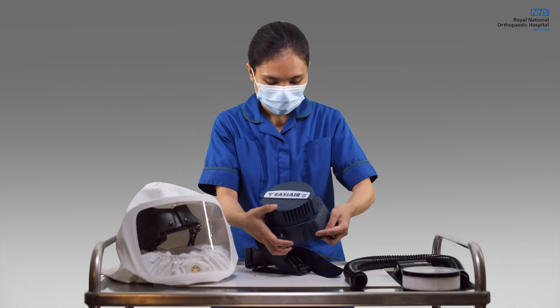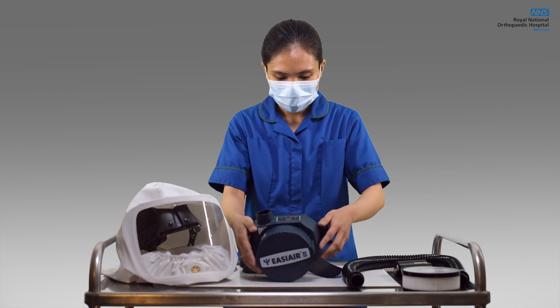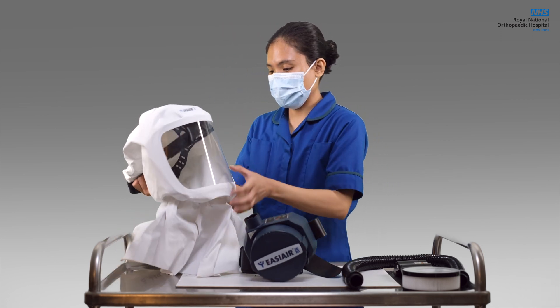Outside the area where a powered hood is needed, check the integrity of the whole unit. Perform a visual inspection and functional test.